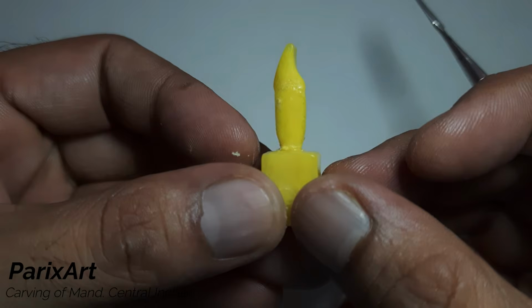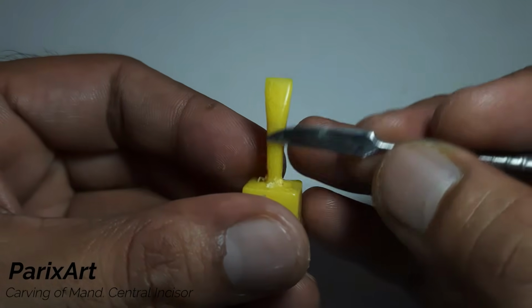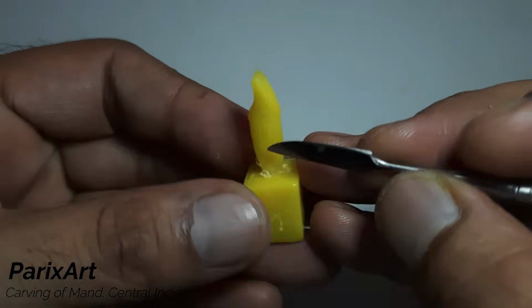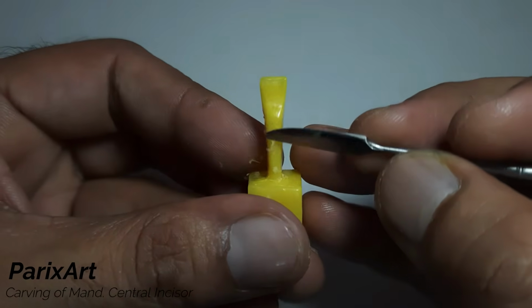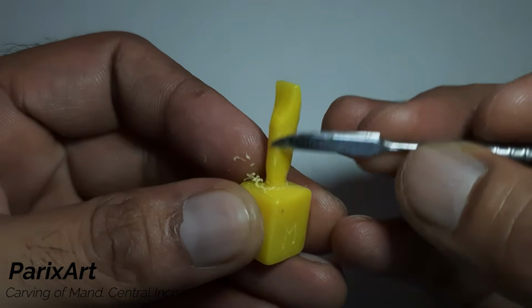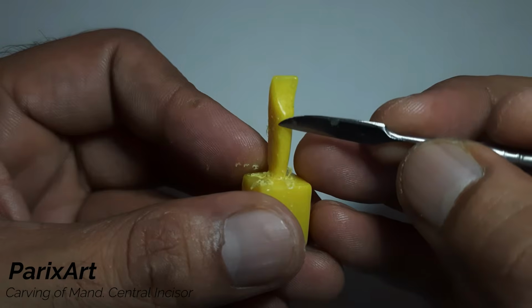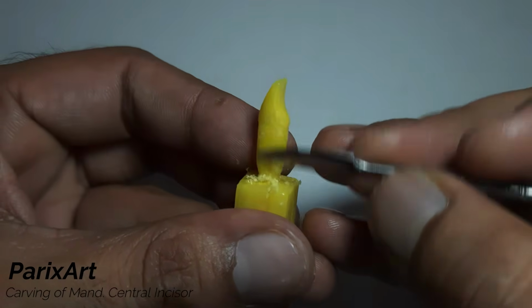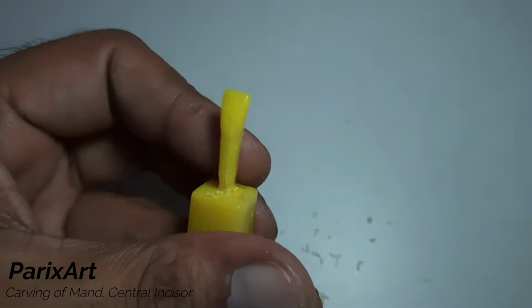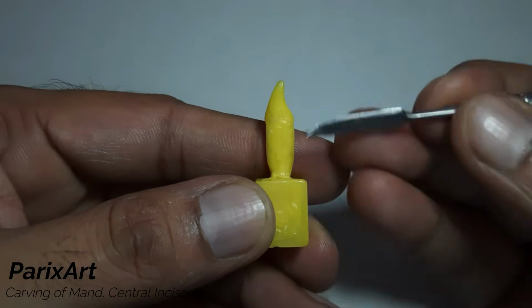See now. Now carve following this cervical line straight down.